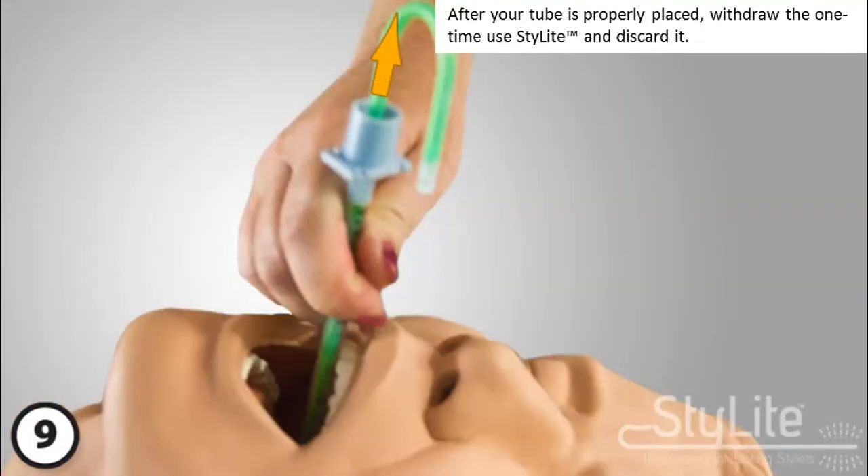After your tube is properly placed, withdraw the one-time used stylet and discard it.